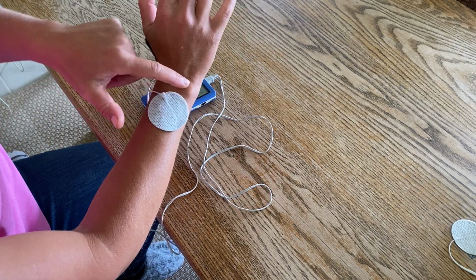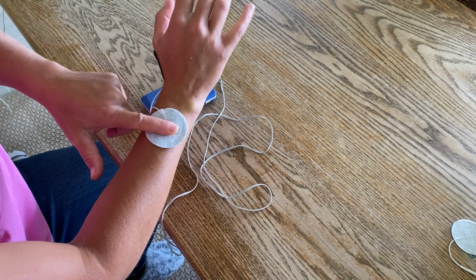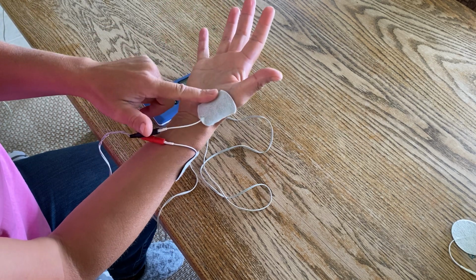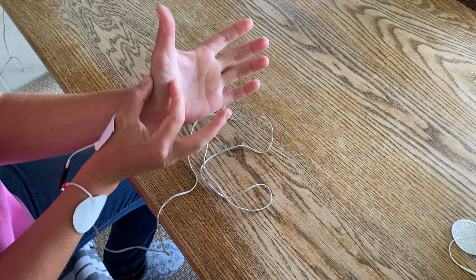I've got one electrode on my wrist, just above the bony bit on my wrist. I've got the second electrode on this fleshy bit around my thumb, which is around here.